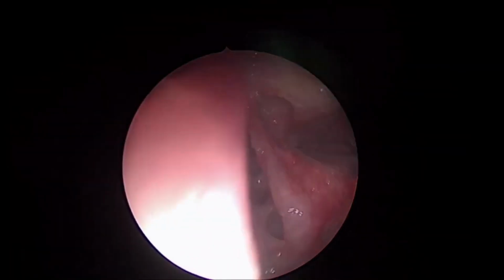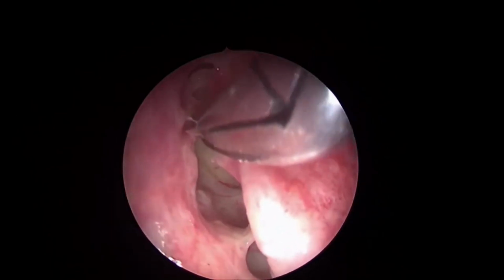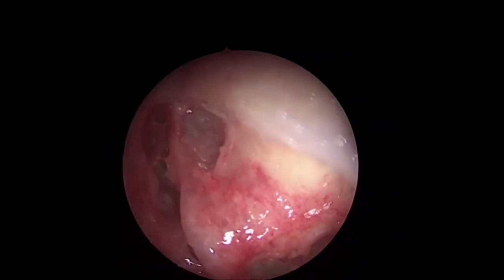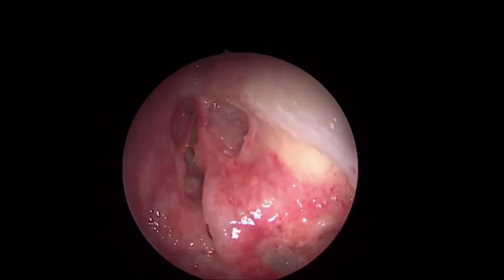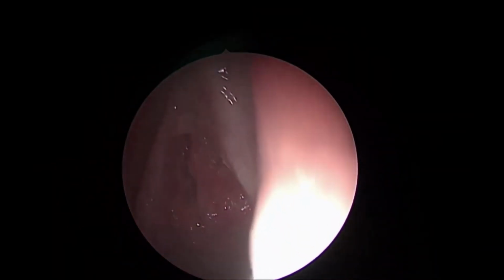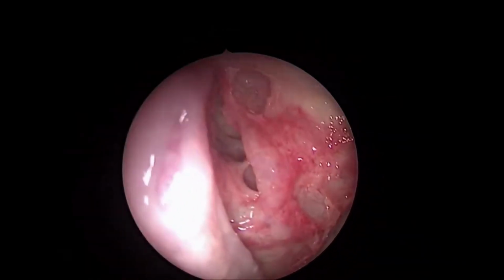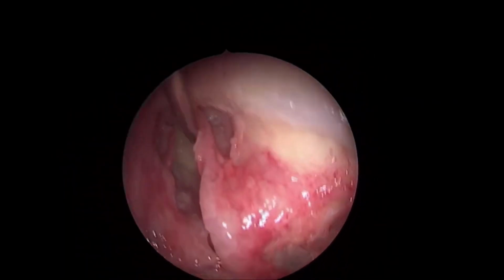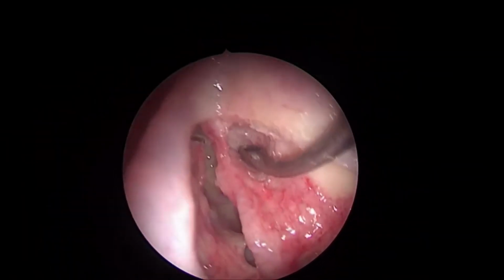In any given difficult situation, because this area is not always so straightforward. There are so many cells which complicate your life, particularly in the presence of disease. There is a certain group of cells I mentioned in the first lecture, second webinar on the radiology, the first group of cells which are lying anterior to this. See this cell lying anterior, this is my access to the frontal sinus. See now, how it is narrowed by this cell.